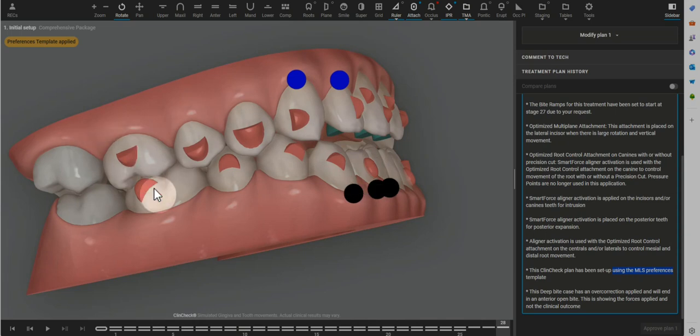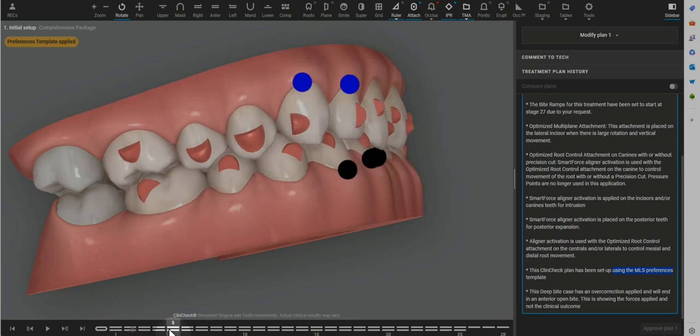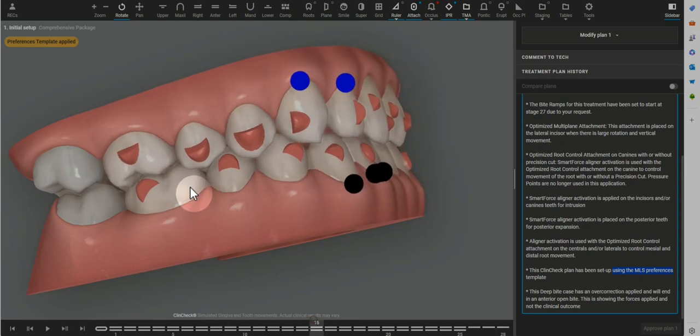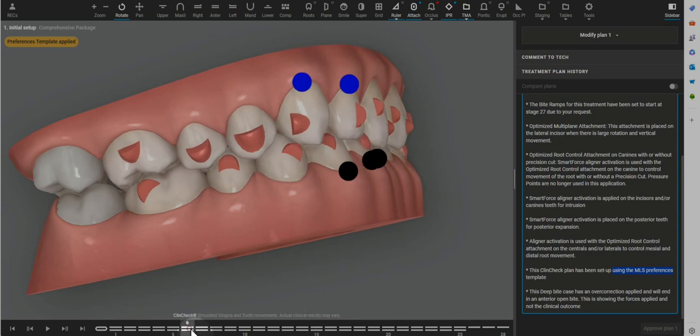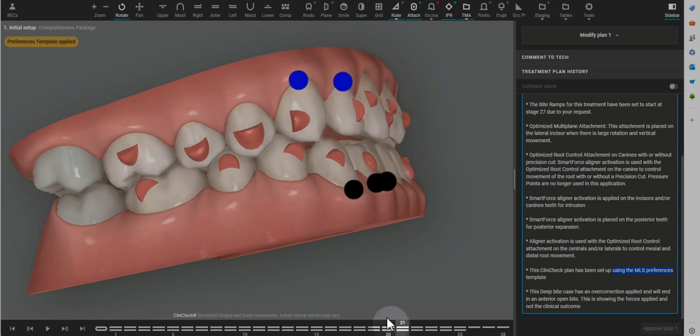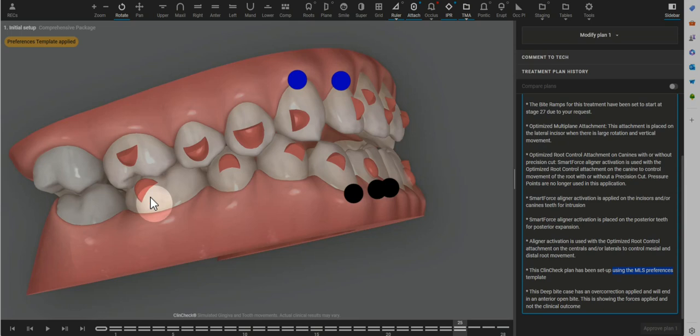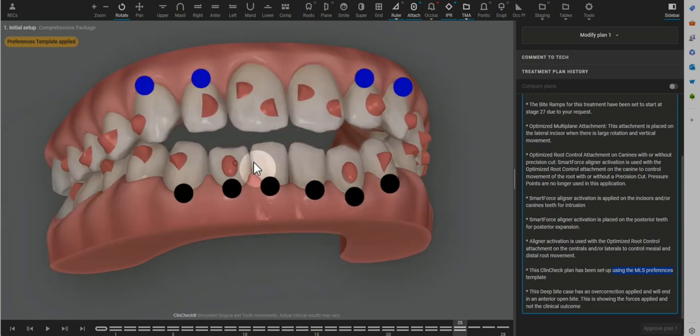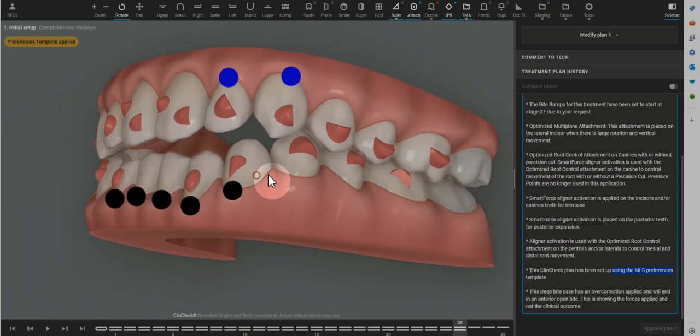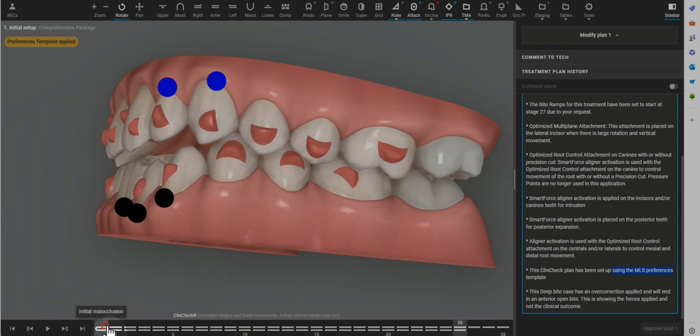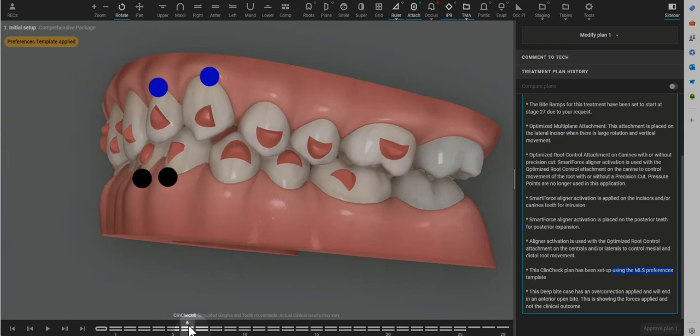Again, the extrusion of the premolars at the end of the case is to compensate for the high likelihood that the molars are going to passively intrude throughout treatment with the lack of bite ramps all the way through. So it's like, okay, we're not going to have bite ramps, but then we got to compensate, add more attachments, add more movements. So it's a little bit of chasing your tail, in my opinion.